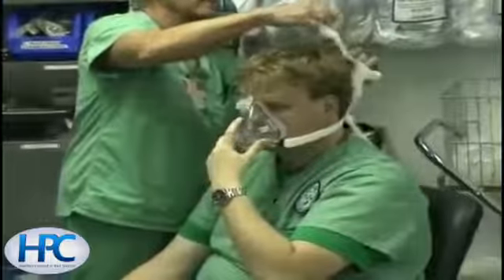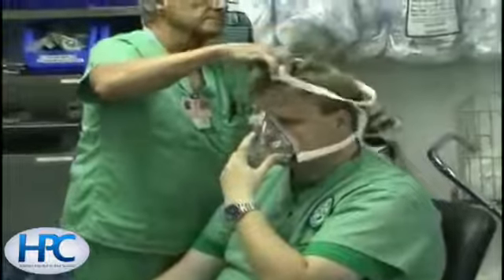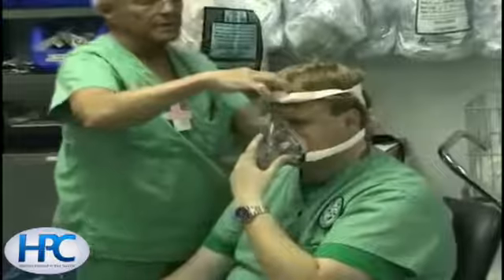The optimal patient for bilevel positive airway pressure ventilation is an alert, cooperative patient who has minimal secretions.